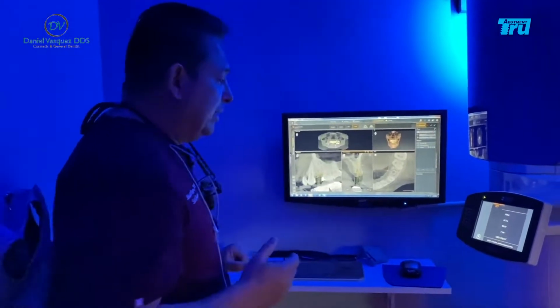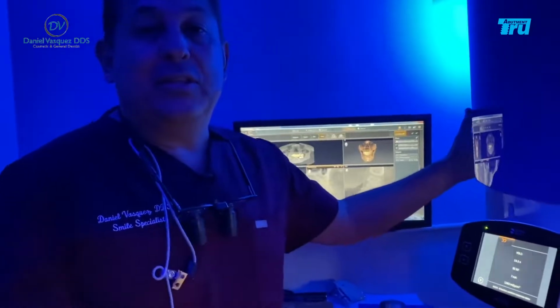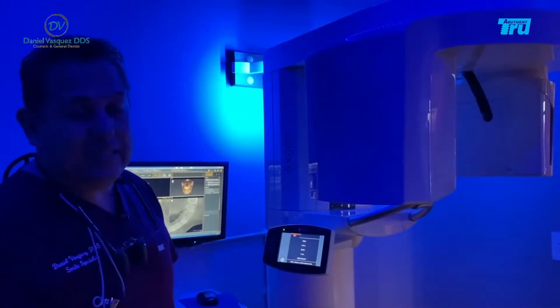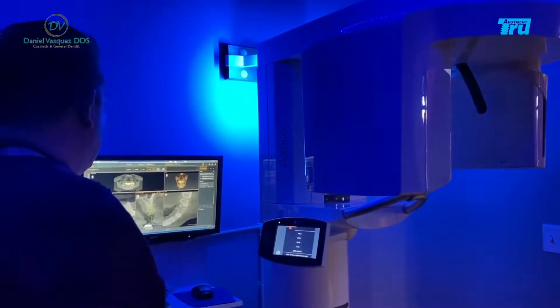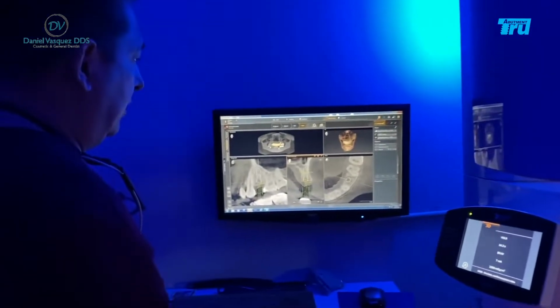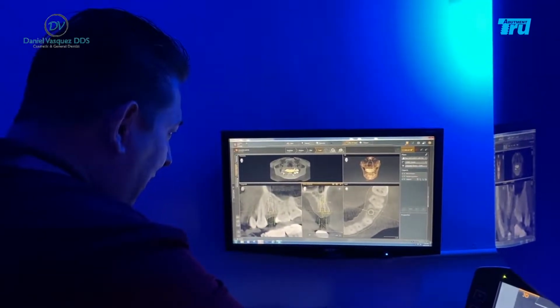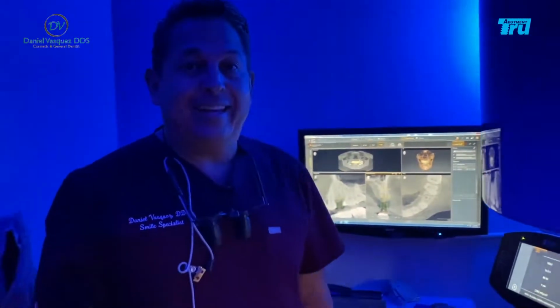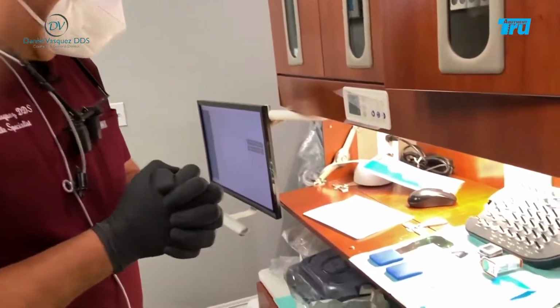So this is the treatment plan that we have today for our patient. Oh, by the way, this is our new beautiful machine, our 3D Axios. It takes phenomenal imaging, so I'm very happy with my new tomography, or 3D CBCT, in the office. So this is our treatment plan. We already planned the implant placement and the surgical guide, and we're ready to place that implant. Patient's ready, and all the tools we're going to be using are ready.